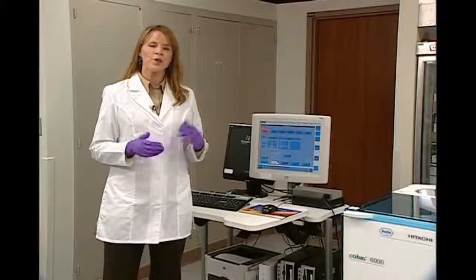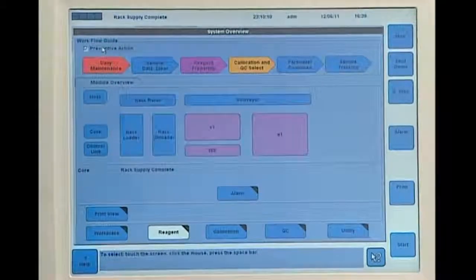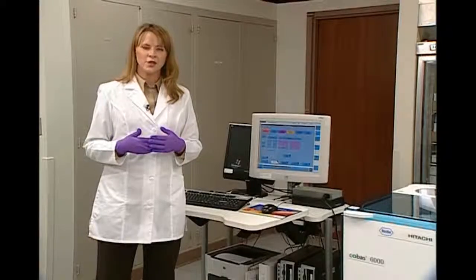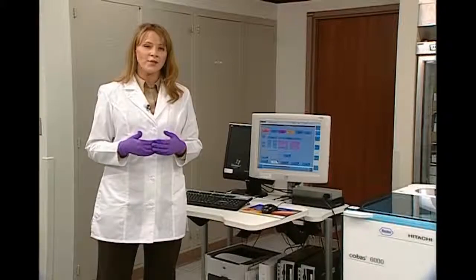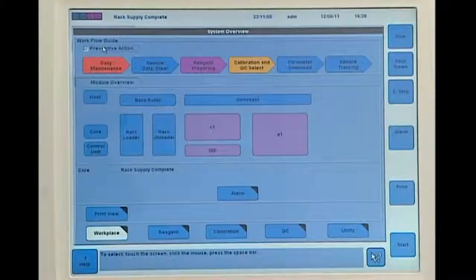To print this report, we're going to go to the system overview screen and select a feature called preventive action. That's going to turn on the purple alarm. The software is going to look at the entire reagent inventory and determine whether or not we have enough reagent to get through a full 24-hour period. So now I'm going to actually print that report.